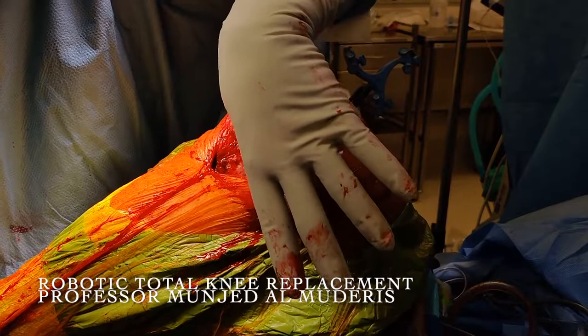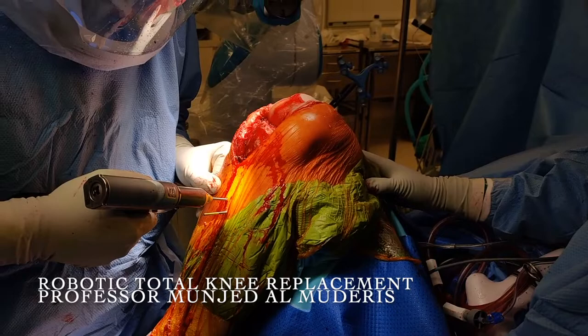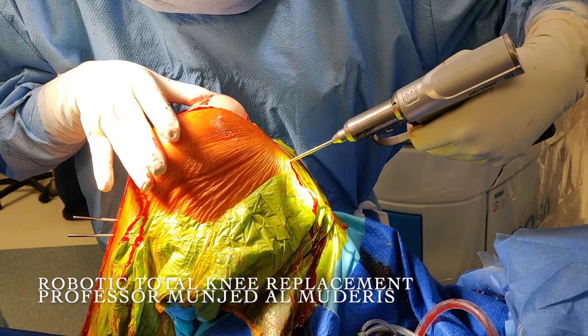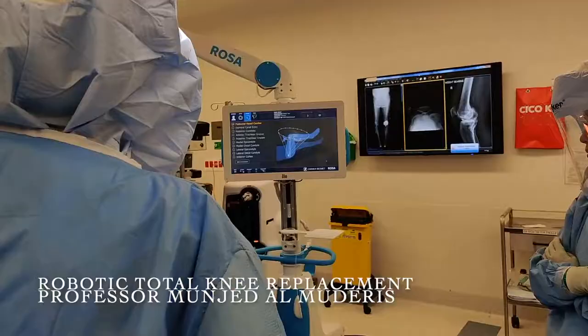We then proceed to position the navigation beacons. I position the pins slowly to avoid heat generation and superficial fracture. We position one navigation beacon on the tibia and one on the femur, then proceed with identifying the landmarks at the hip, the knee joint, and the ankle.